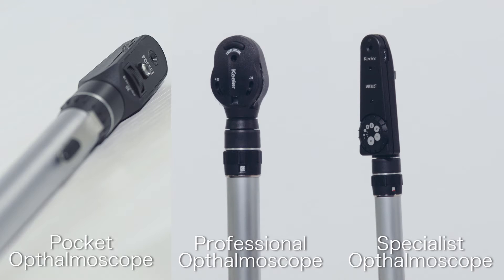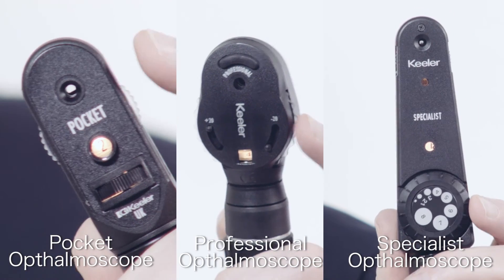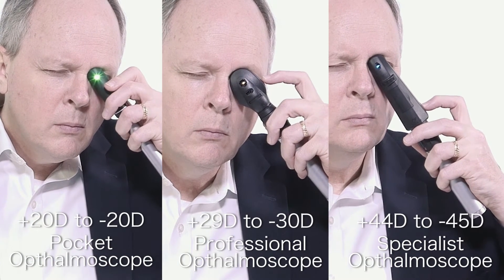Let's begin with the ophthalmoscope line. The lens wheel is rotated to select the required lens. Keillor ophthalmoscopes include a comprehensive lens range across the ophthalmoscope line.